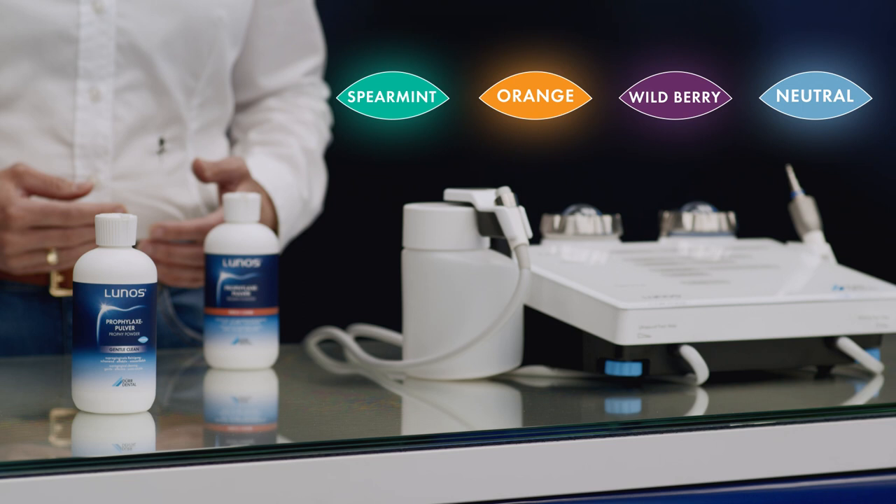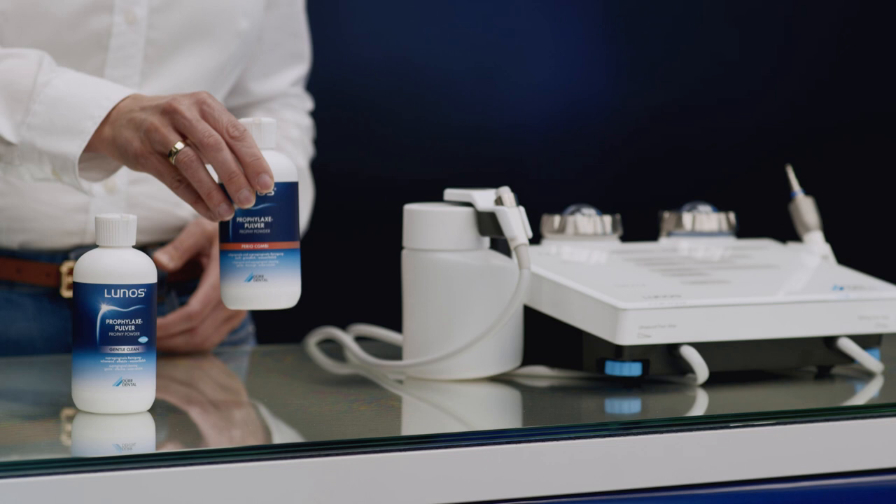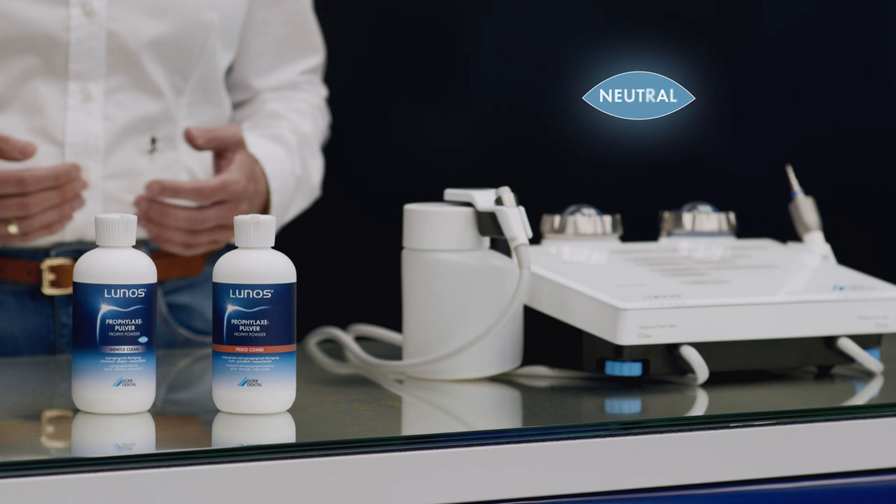LUNOS profi powder perio combi, which has an average grain size of approximately 30 micrometers, is suitable for both applications — supragingival and subgingival — and is also an excellent choice for recall sessions.